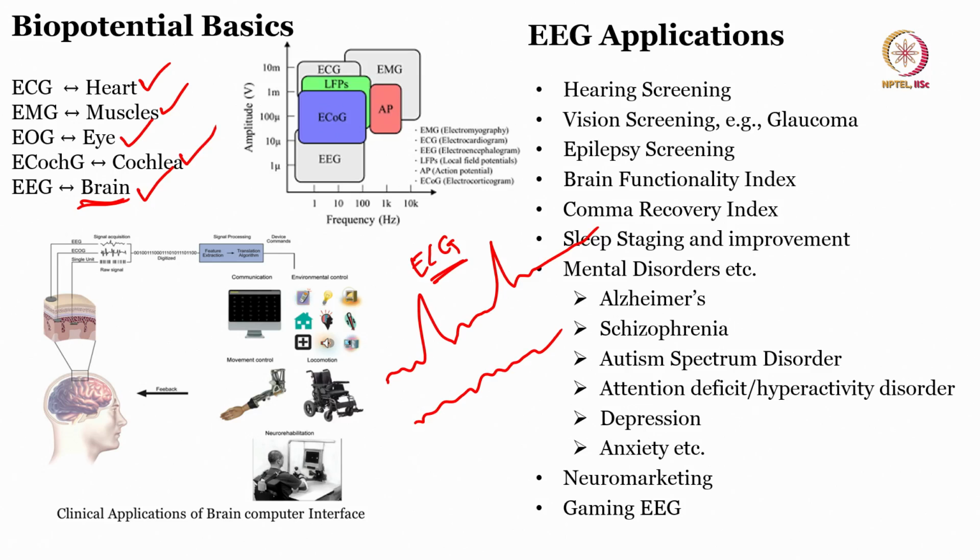So EEG, right? EEG is a non-invasive measure. Non-invasive means you don't need to do any form of surgery or any form of cut on your body to perform this particular thing.